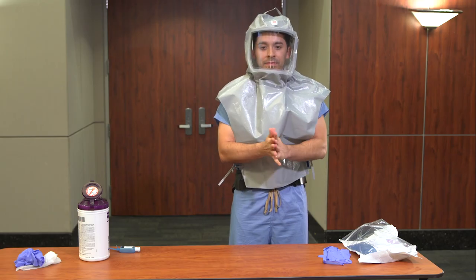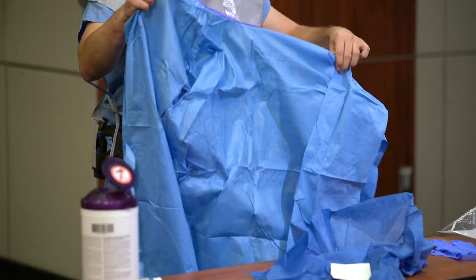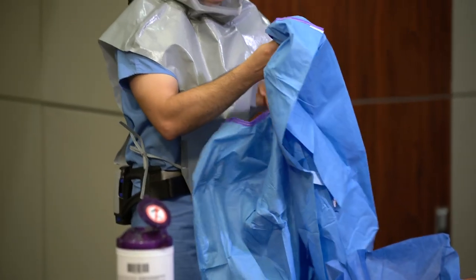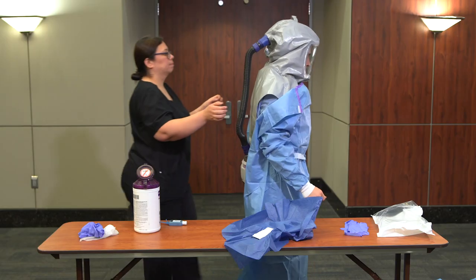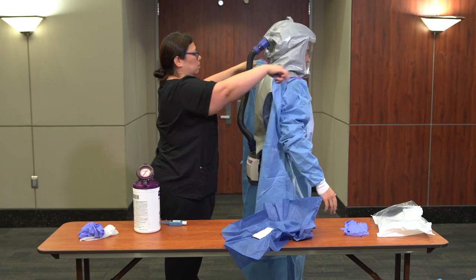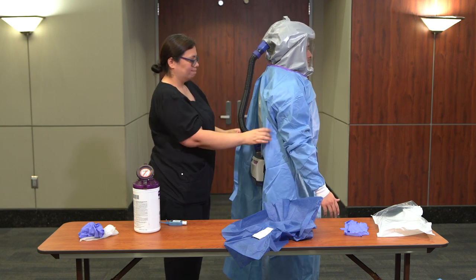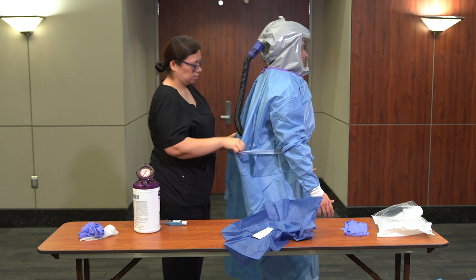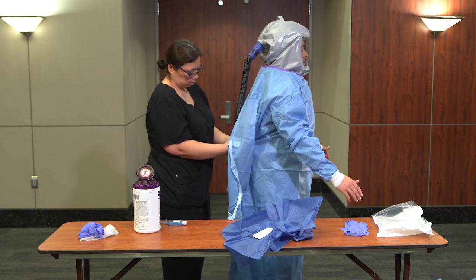For donning PPE for the next patient, the healthcare worker should perform hand hygiene. Don the surgical or reusable gown. The buddy should assist in fastening the gown in a manner that allows the air hose to move freely. The gown should fully cover the torso from neck to knees, arms to end of wrists, and wrap around the back.